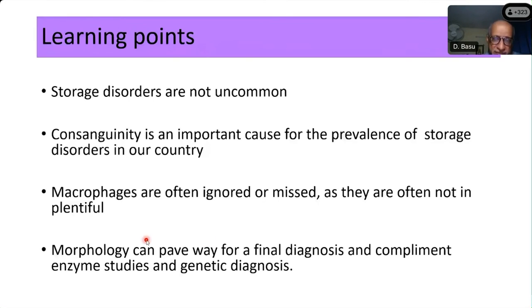Currently, not too many people are doing marrows for storage disorders because enzyme and genetic diagnosis is becoming available in most places. But it's a good learning exercise to pick up marrow macrophages and macrophage disorders in the marrow. Any queries, clarifications or questions, I'll be happy to take.